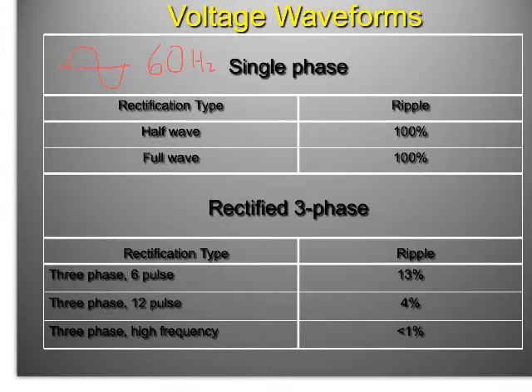power. So if you take your blow dryer to Europe, number one, you won't be able to plug it in because their plugs look different. But if you were able to plug it in, you would blow it out because they use a totally different cycle. The power might be the same, cycles are different. Okay, and that's important. So we've got to fix this cycle somehow.